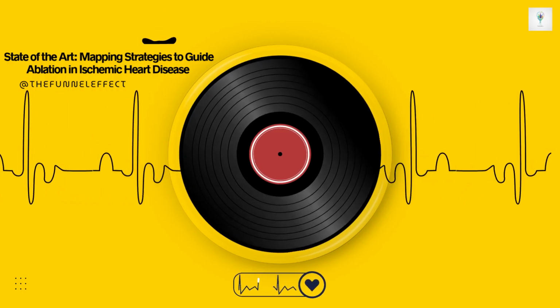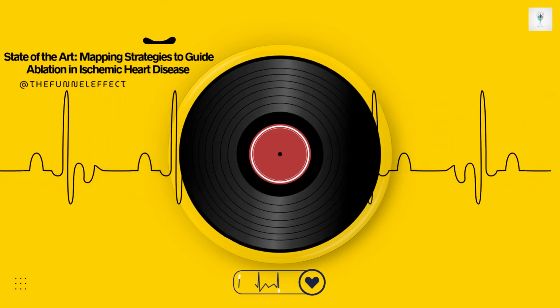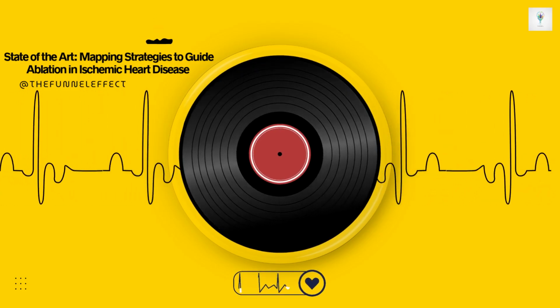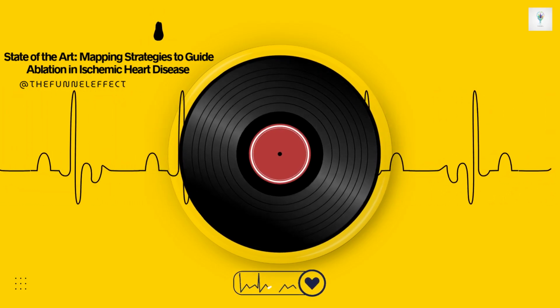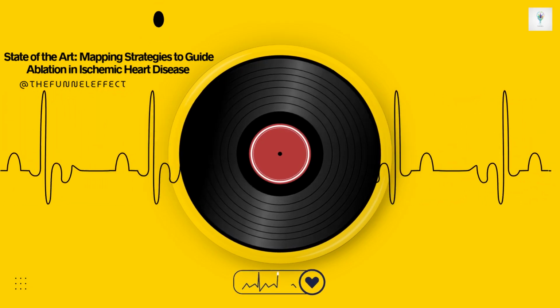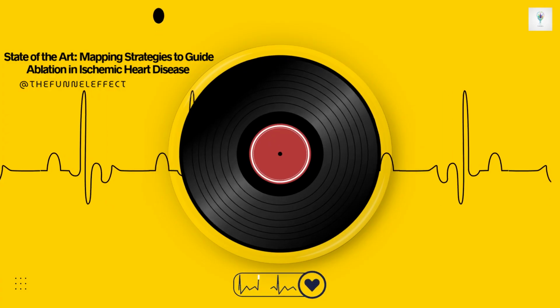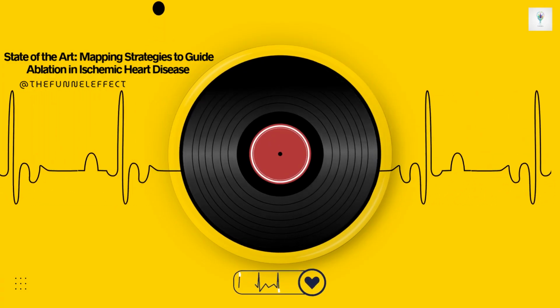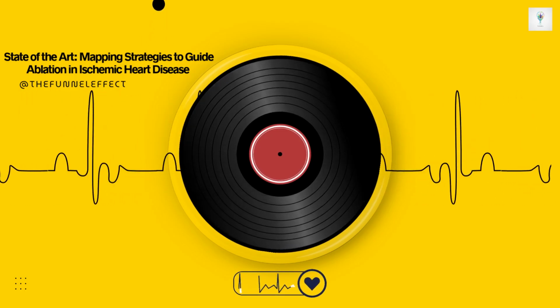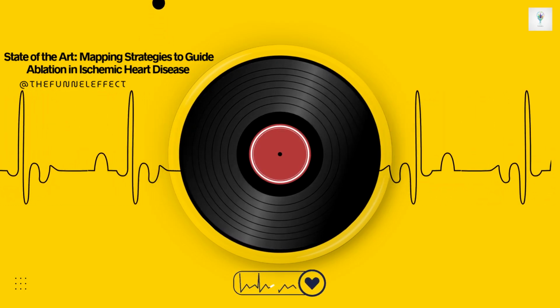Sort of, yeah. The LGE highlights the dead fibrotic tissue. So the thinking is the viable channels, the potential isthmuses, must lie between these dense scar areas, or maybe along their edges. It gives you a predicted map, suggests where to really focus your initial voltage mapping. Sounds very helpful. But then comes the moment of truth, often involving programmed stimulation, PS, actually trying to induce the VT. Why take that risk up front?